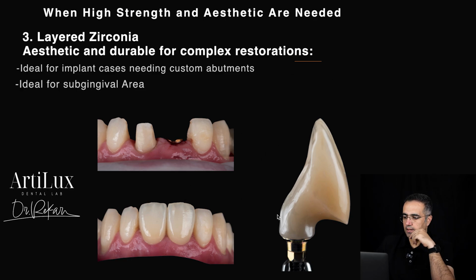the hybrid abutment and then only layered the facial and proximal areas with the feldspathic ceramic to mimic the natural tooth. This is a very nice way to make an aesthetic and still strong restoration.